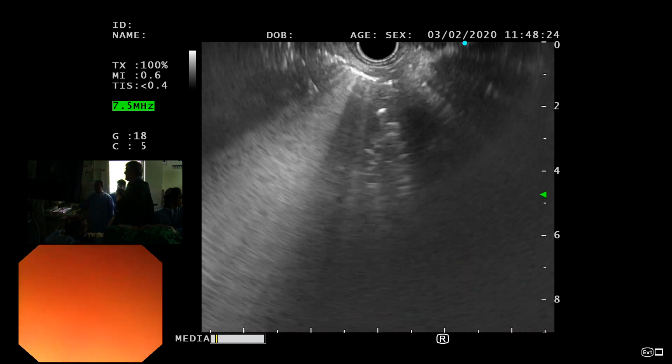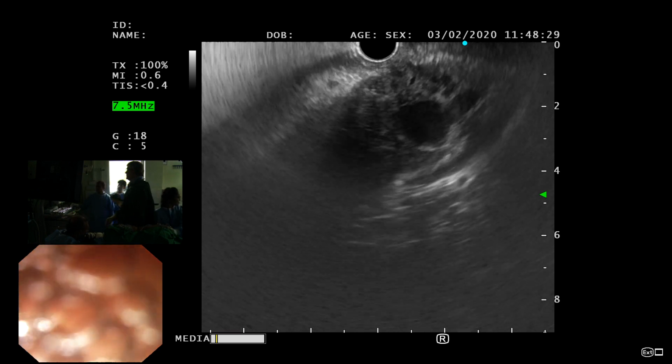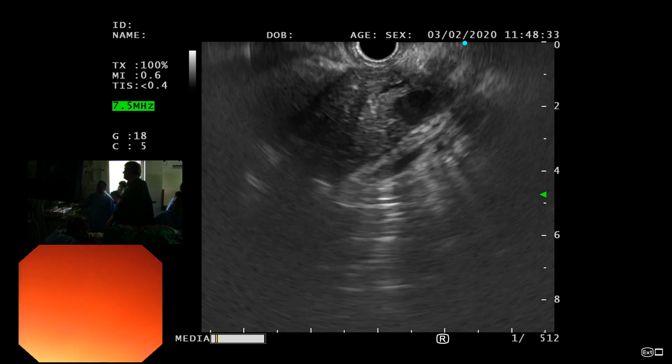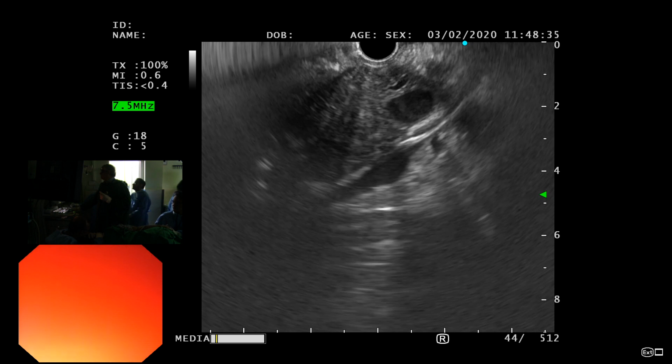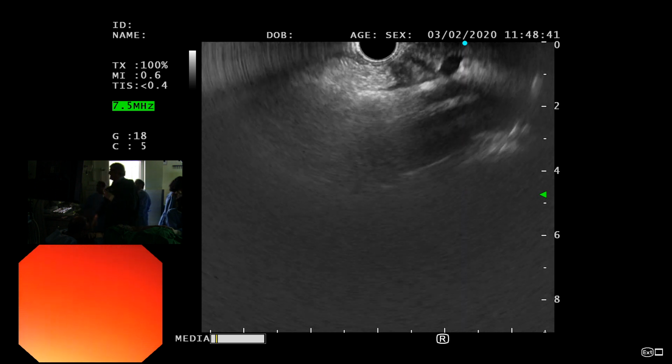Are you worried about that duct, Khalid? Can you show me that again and complete that area? Yeah, there you saw that. Ek minute picture le lo. Yeah. It's a little bit prominent. What about going into the neck area? Can you? मैं वही follow जा रहा था. I was just going to have a look at it, but yeah, saw it here nicely. Can you follow that?